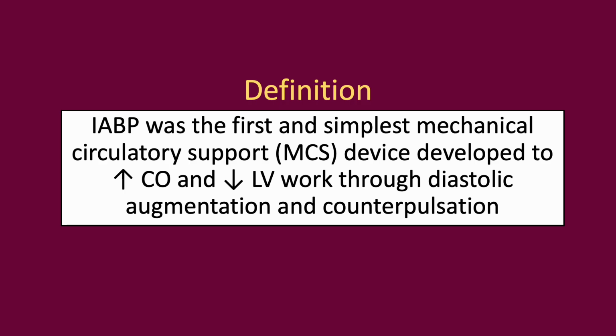Kantrowitz first described augmentation of coronary blood flow in animal models in 1952. Nevertheless, the aortic balloon pump was first introduced in the 1960s with the aim to support coronary and systemic circulation. The cardiac support device is achieved by synchronous counterpulsation, whereby an intra-aortic balloon inflates during diastole and deflates during systole, with an aim to increase myocardial function by increasing myocardial oxygen supply and reducing myocardial oxygen demand.